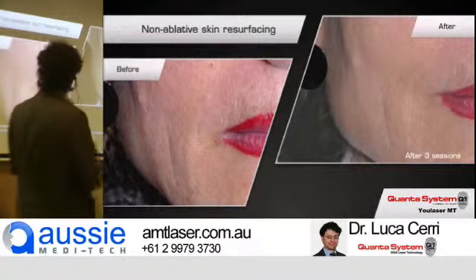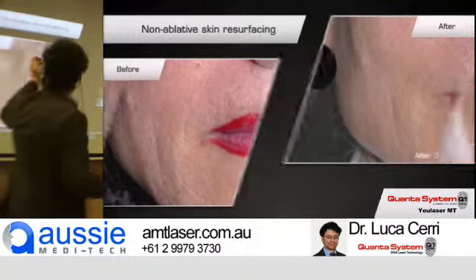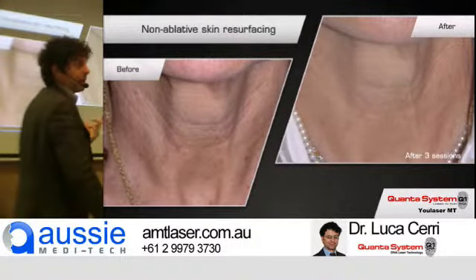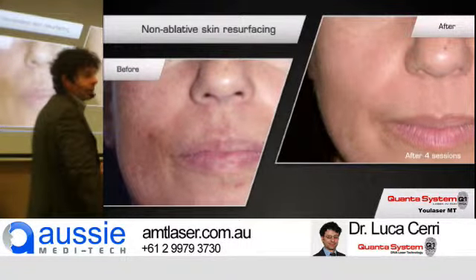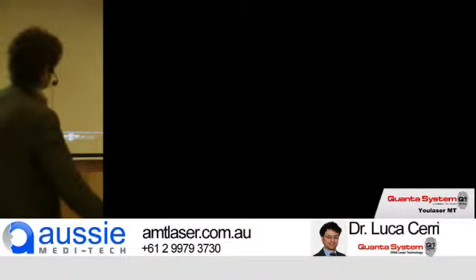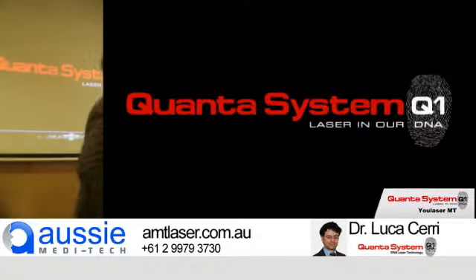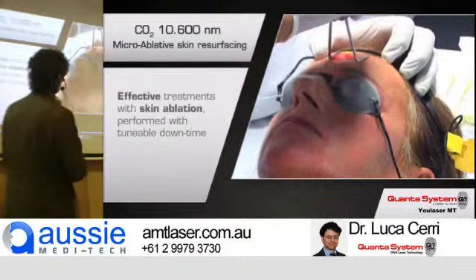With the patient, we have to talk and investigate what they can receive as a treatment and what they want, to agree with you about the approach and about the downtime. And based on that, we can treat. This is a 1540 only, where we can have some tightening. Also in this case, an improvement of the neck. But if we try on deep wrinkles alone, we will not have results comparable with the combination.